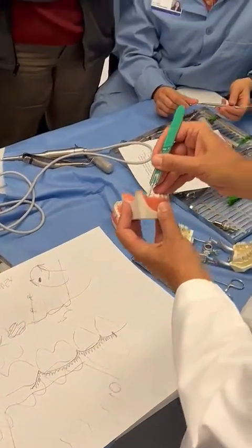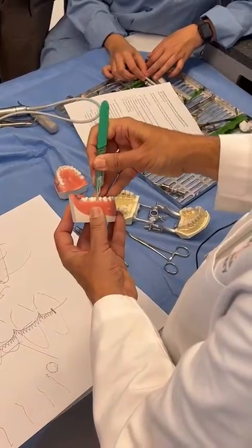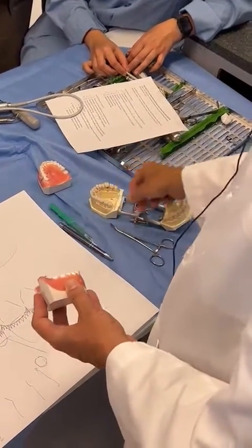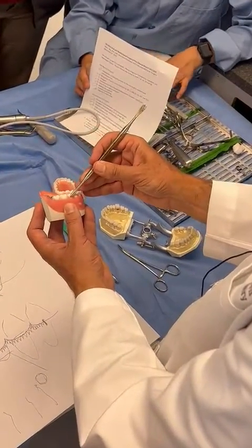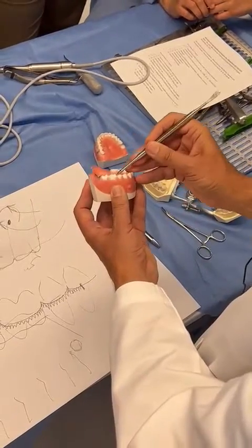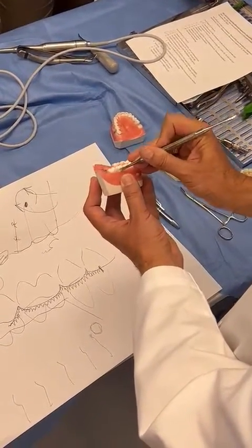You go in here, once again, you push, push, push, stay contacting it, okay? And then the number 9 Molt. Then you'll put this into the embrasure space and you'll push, push, push. You might flip and pry, flip and pry.